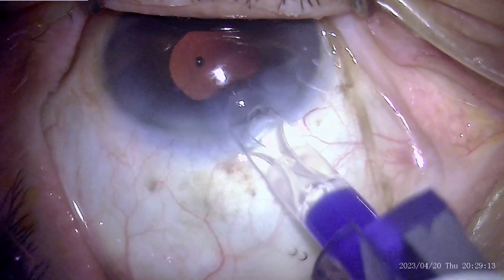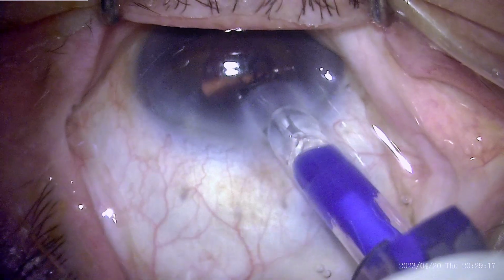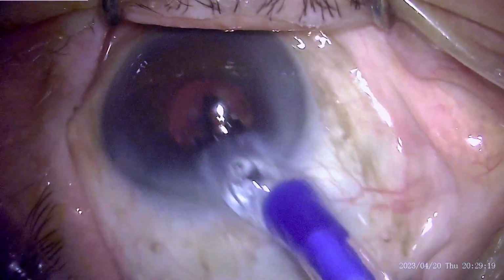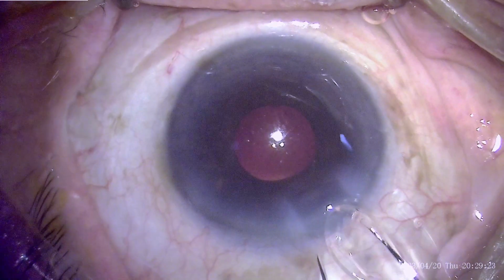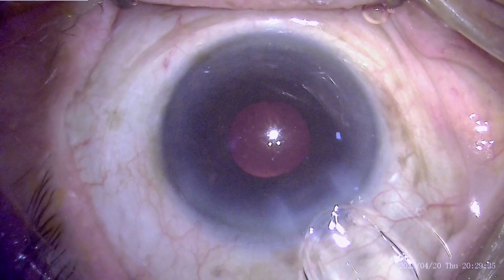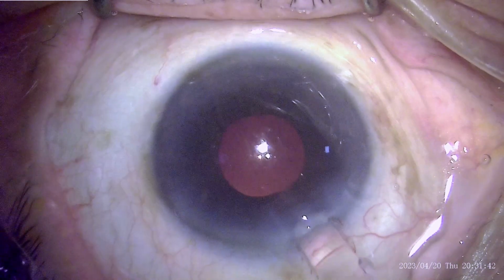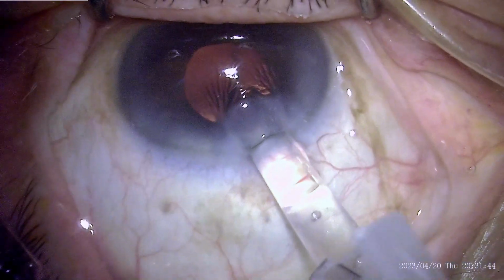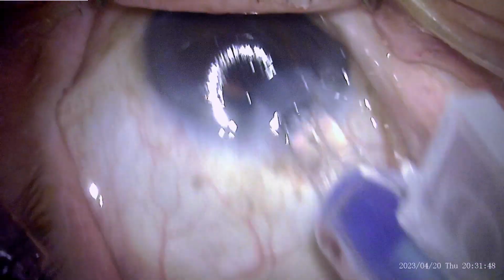Now this is a preloaded lens, but I could see that the tip is not getting accommodated and the IOL burst out of the tip, and then I realized that this tip is meant for a 3.2 mm incision, so a new tip was used, and this is a thick IOL because it is 26 diopters.